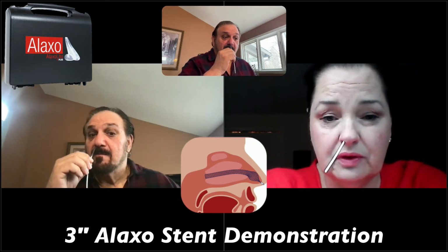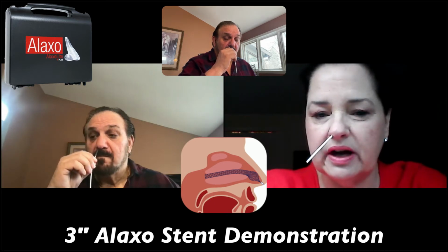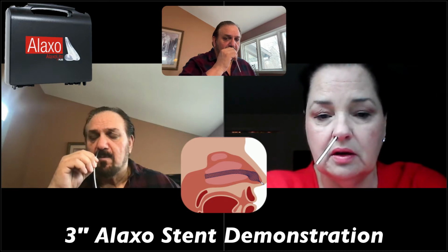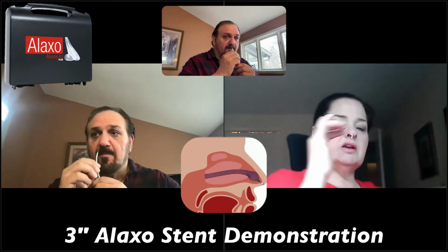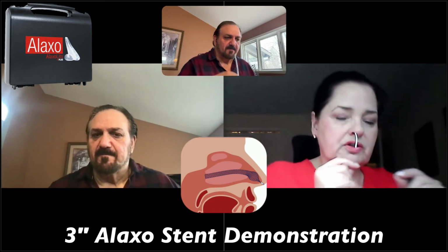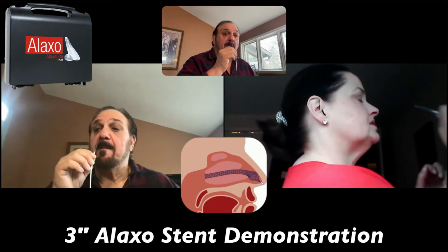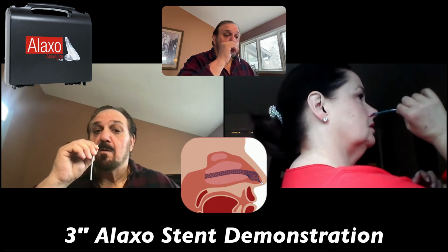Maybe I have to go see my ENT. You may have to. Everyone is different. Is your nose dry? If your nose is dry, you can use some lubricant. I went a little further this time. That's fine. It's just coming right up against the wall. It feels like a wall, but it probably isn't. It looks like you got a little bit further this time. I'm thinking that maybe you have it downward a little bit. It seemed to me like you were going like this to go in. You need to be like here.